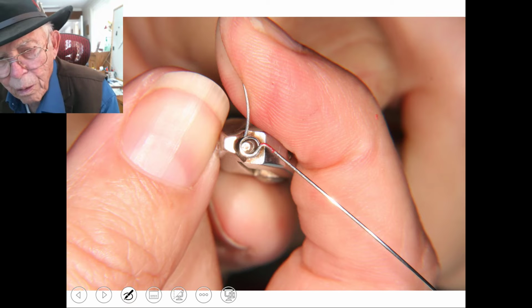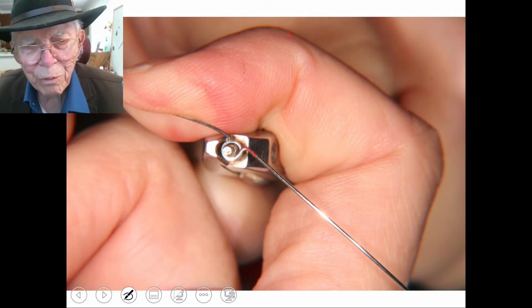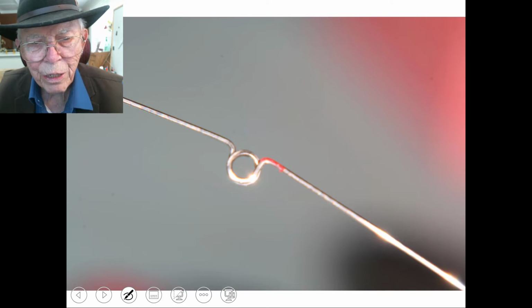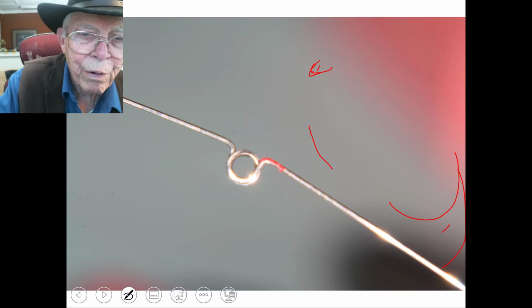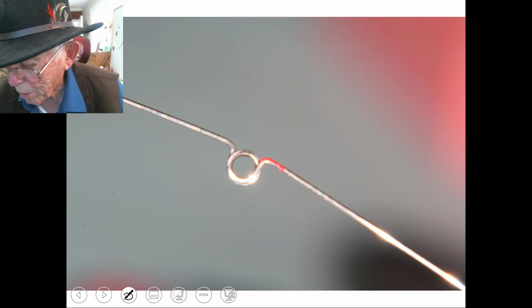Okay. Now, if you know how to bend these, then you don't have to look at this. But there are many, many people that do not know how to open these deep bite cases, and this is the best way I have ever found to do that. Now we're going to push that down. Now that's made. We've got another one to make over right on the other side. This wire will curve around and go like this, and we'll make another one right there. And then we're going to activate these and show you how that goes.